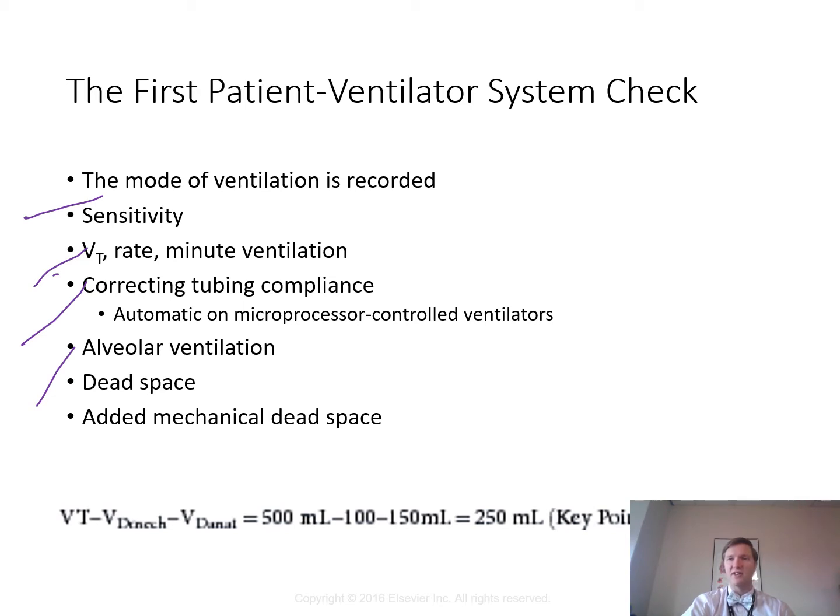When you're going to these very low tidal volume strategies, inline HMEs can be a big issue. And so what we're going to look at with these patients is the lower the tidal volume we go, things like HMEs, heat moisture exchangers, closed suction systems, other circuit adapters, equipment like MDI adapters can add what's called mechanical dead space to the ventilator and affect their dead space to tidal volume ratio. In other words, the patient's not getting an appropriate tidal volume because they're being robbed of it by the HME, by the adapters, by all that stuff that's in line.